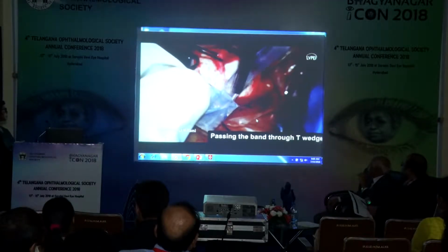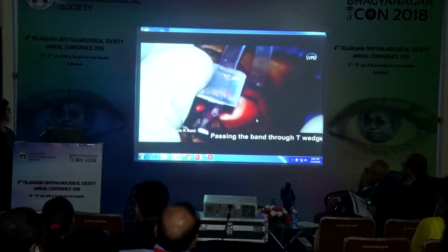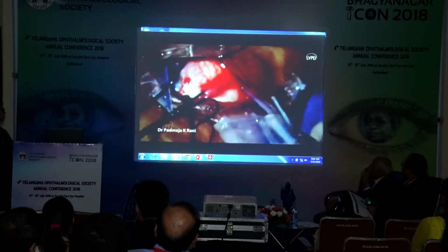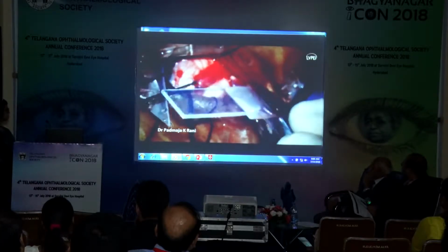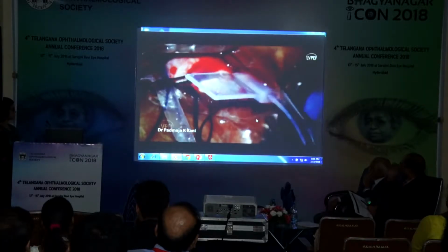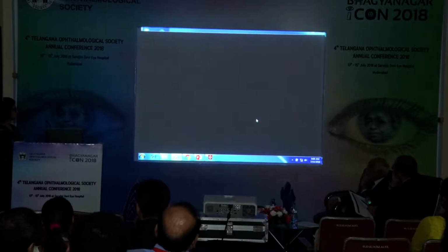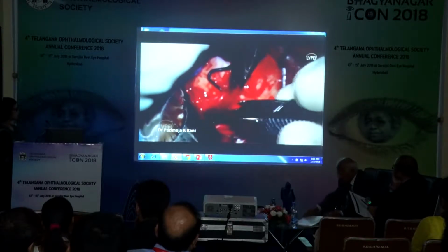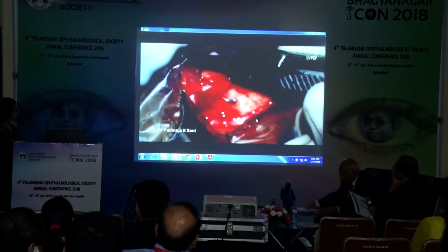The modern-day T-shaped macular buckle is prepared with a 4 mm wide silicone band passing through a 7 mm wide silicone macular wedge that appears convex on one side. The silicone band was negotiated under the 4 recti, 2 oblique muscles and the inferior vortex veins.